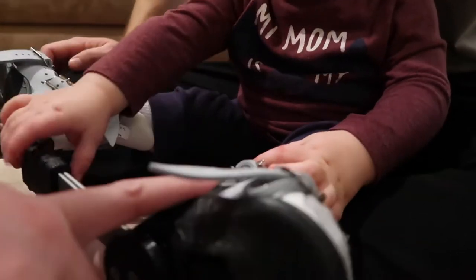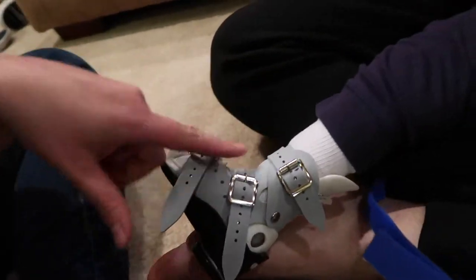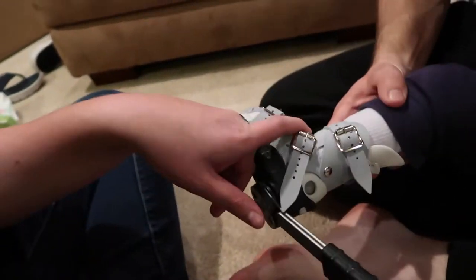When you're taking it off, just like when you put it on — you start in the middle when you take it off, because that's the main point of pressure.